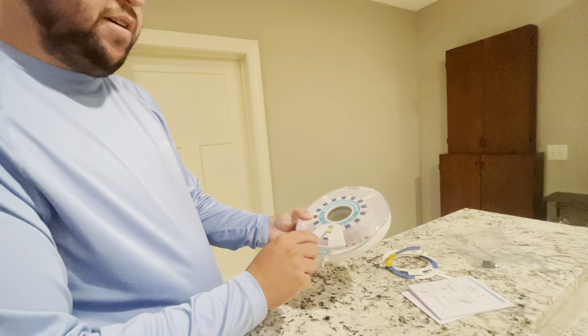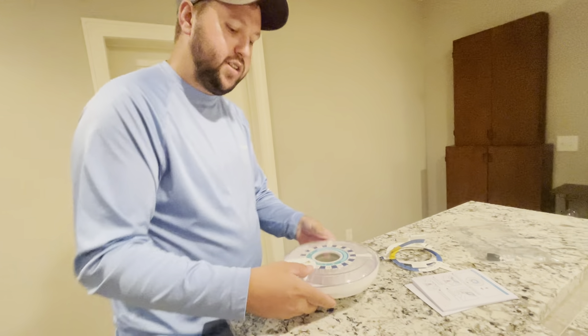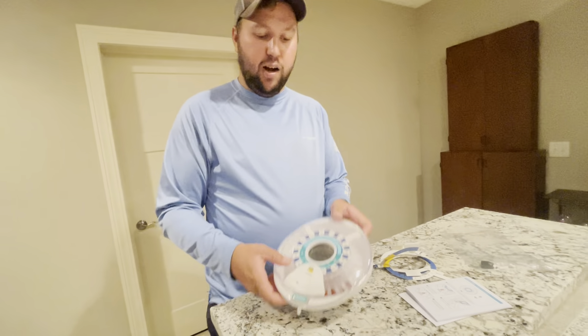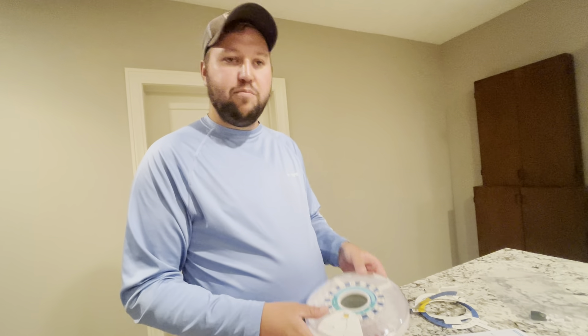Whenever you want to take your pill, this will slide open and you can just grab your pill exactly where you need it. Really, really nice product to have for a loved one that is always forgetting to take their pills.